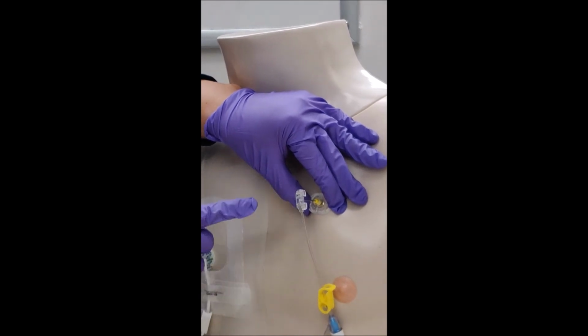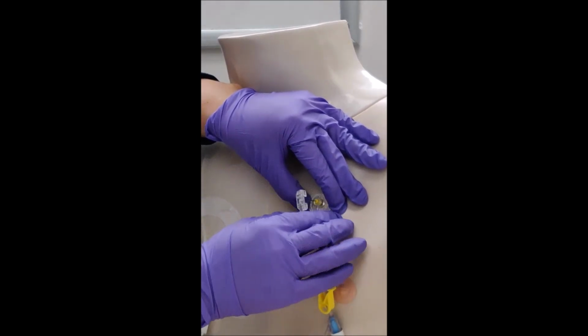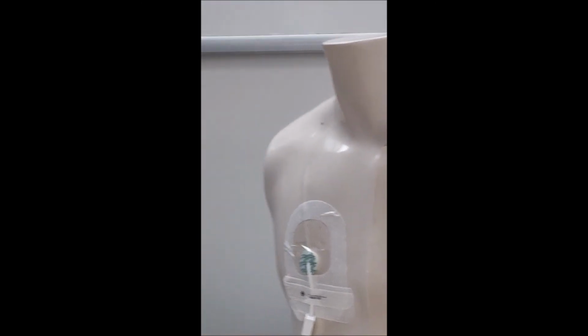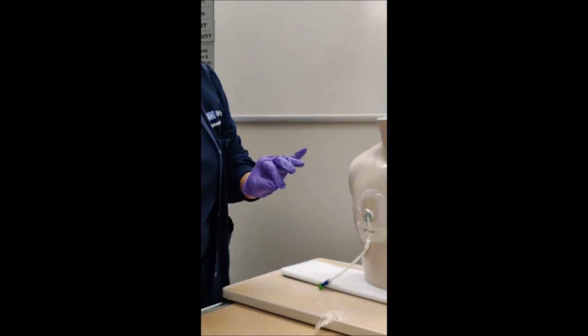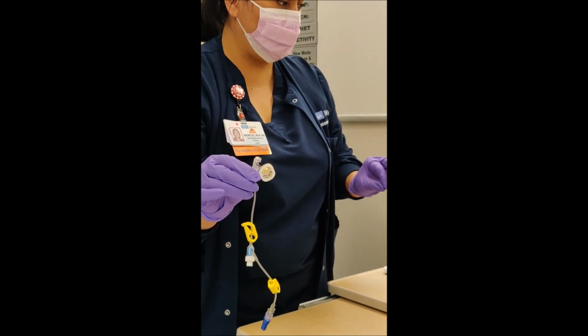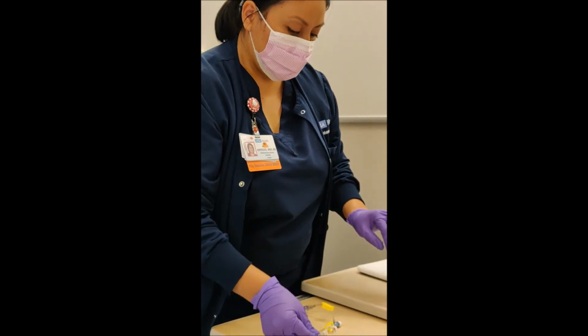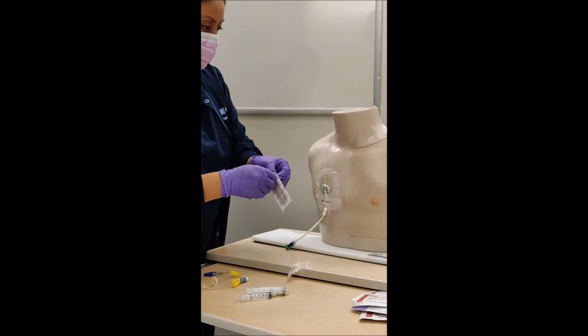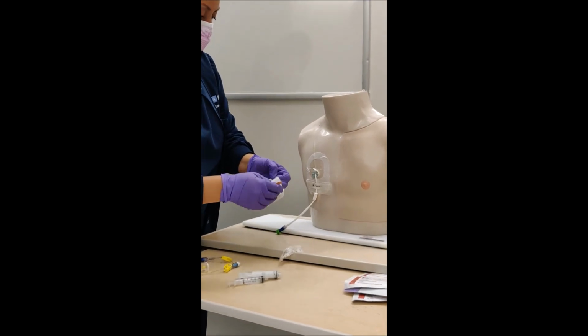So the needle has retracted back. And now I am able to remove and make sure that I don't have a risk of sticking myself with the needle. Once we're done, this goes to the sharps container, and then we would just apply the Band-Aid.